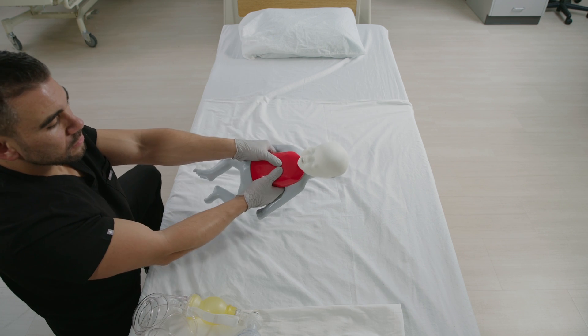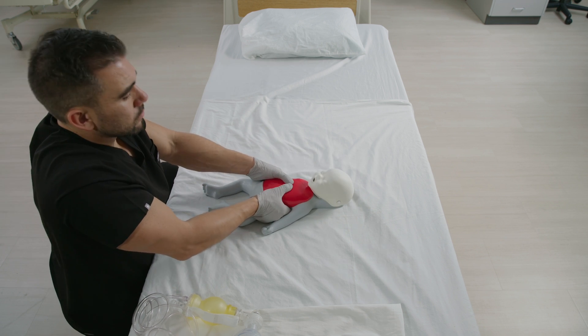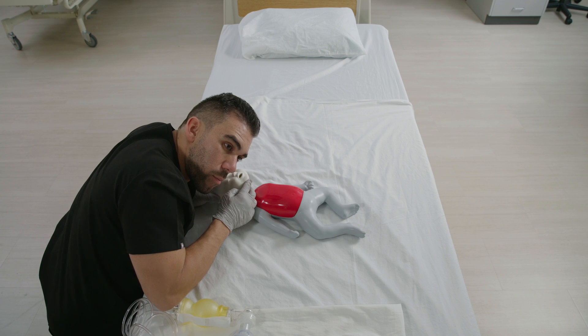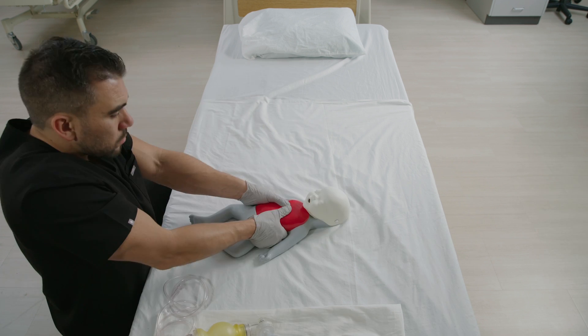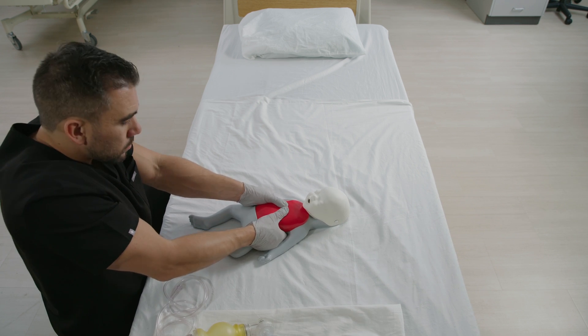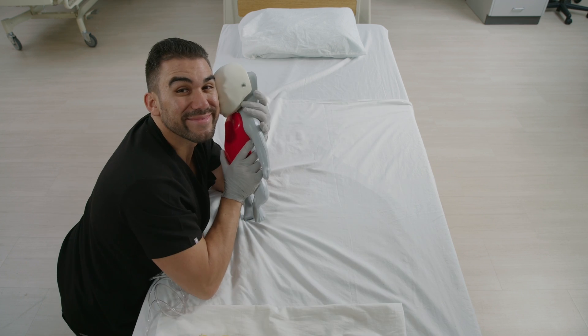Use both thumbs to press down. The depth of compression should be about 1.5 inches at a rate of 100 to 120 per minute. Open the airway using a head tilt or chin lift technique and give 2 breaths. Continue 30 chest compressions and 2 breaths, but if there's a second rescuer available, it changes to a 15-to-2 ratio, or until obvious signs of life, or if EMS arrives.